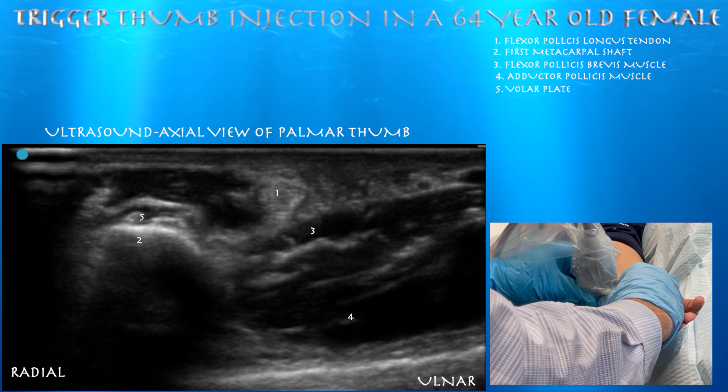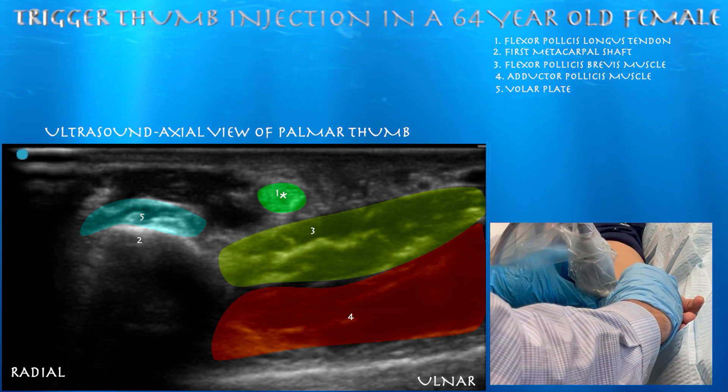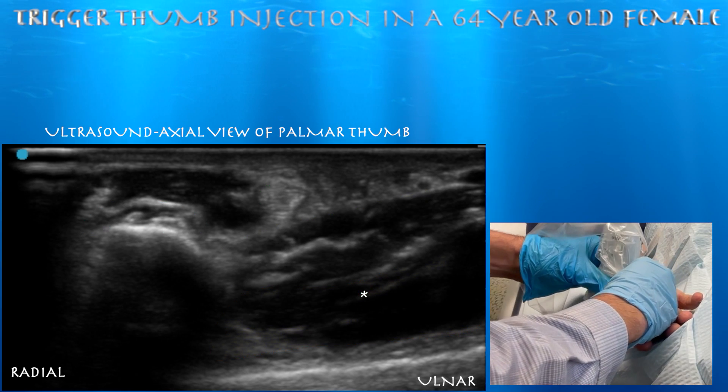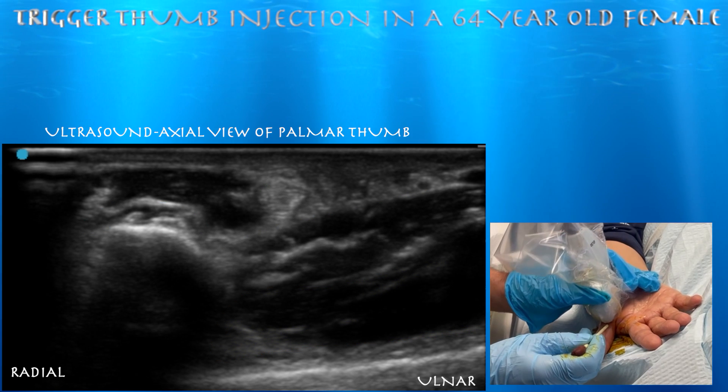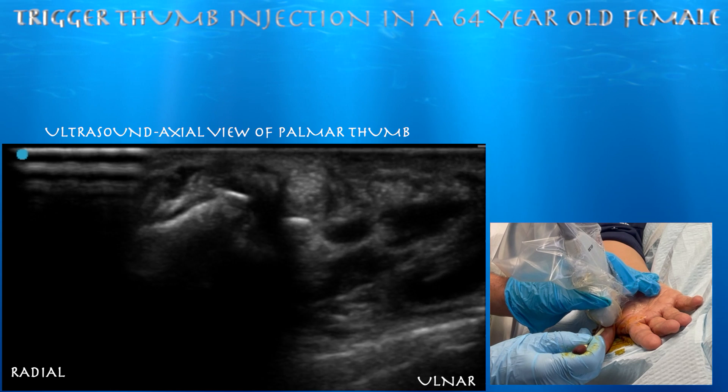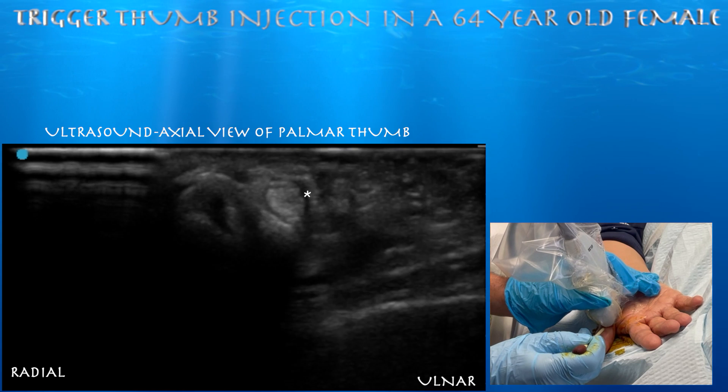Now we're looking at the flexor pollicis longus tendon in short axis, or axial plane. You can also appreciate the flexor pollicis brevis muscle, as well as the adductor pollicis muscle. You can appreciate a little bit of fluid perhaps around the flexor pollicis longus tendon.